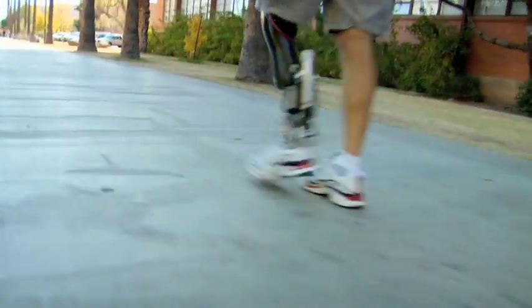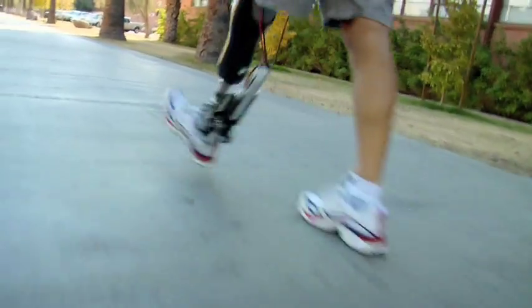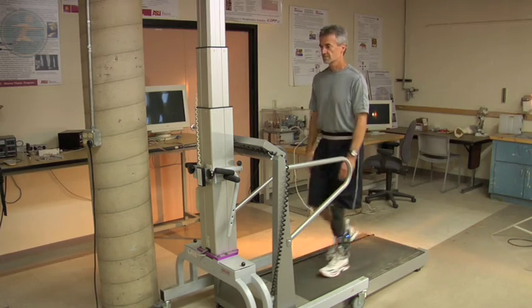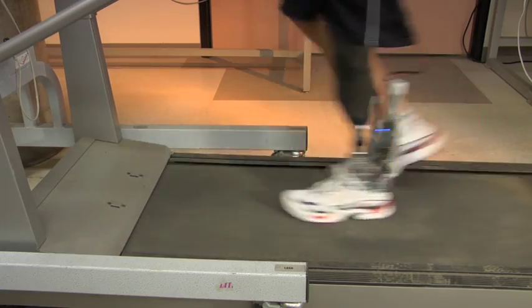It feels like the energy is coming from my lower leg, so it's a very natural feeling. We were asked to develop a powered prosthetic ankle for the United States Army. The powered ankle allows a person to walk normally — it gives the ability for the foot to articulate and adds power to propel the person forward.